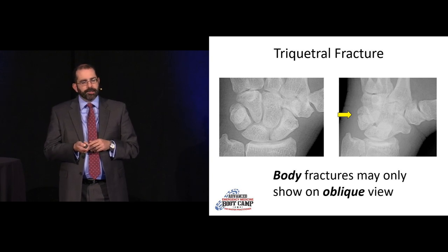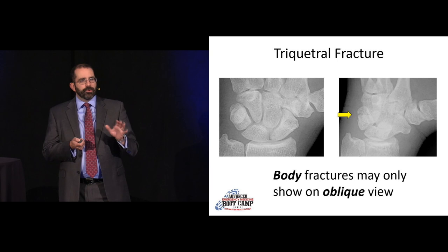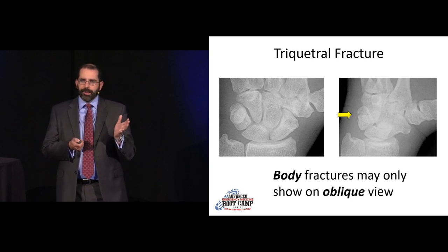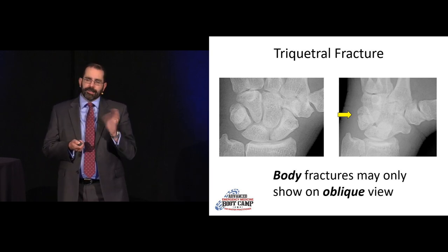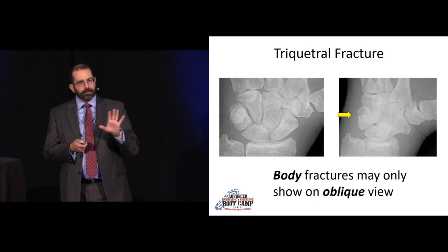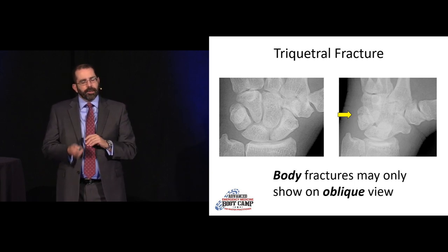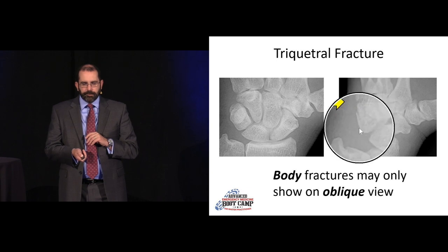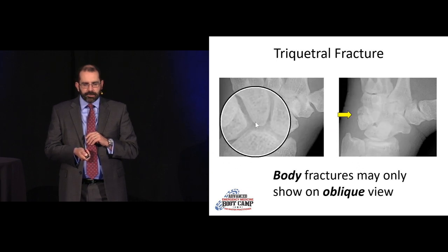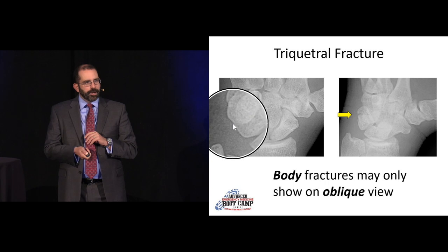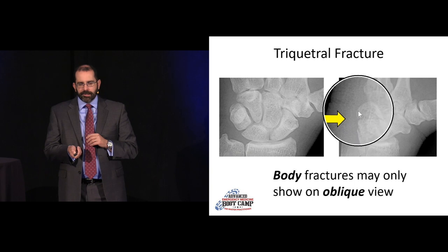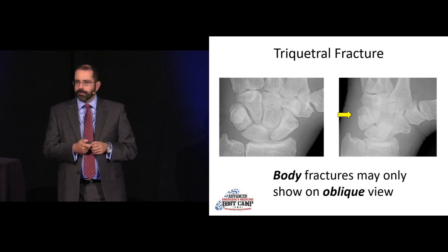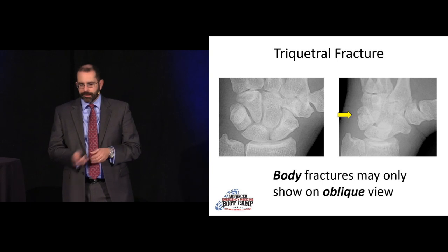If you miss this little chip fracture, it's not the end of the world — we splint mostly for comfort, and as long as there are no other injuries it's more of a nuisance fracture, but it's poor form to miss anything. Look on your lateral for triquetral fractures. Body fractures can be subtle — just like in the foot, we get different views. We get an AP, oblique, and lateral. We get an oblique specifically for a better look at the triquetral body, which the pisiform can hide on the AP view.